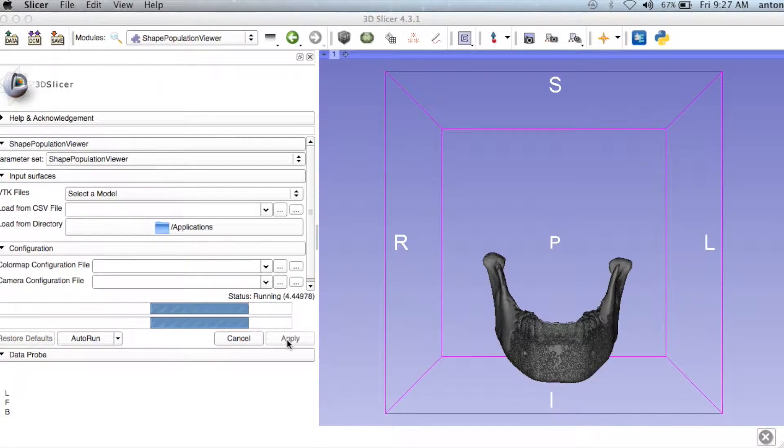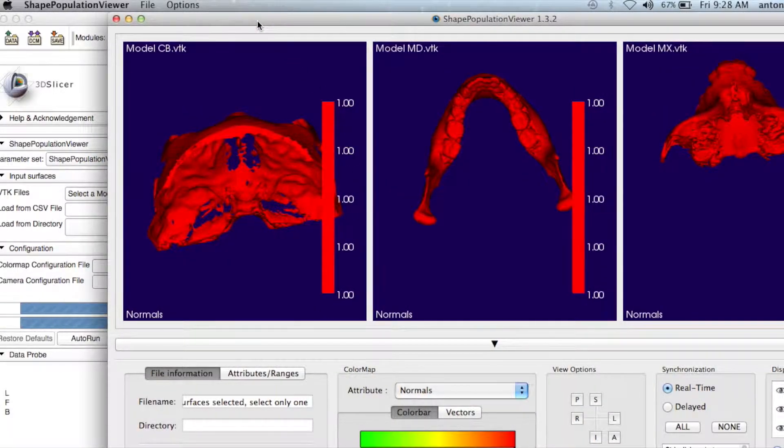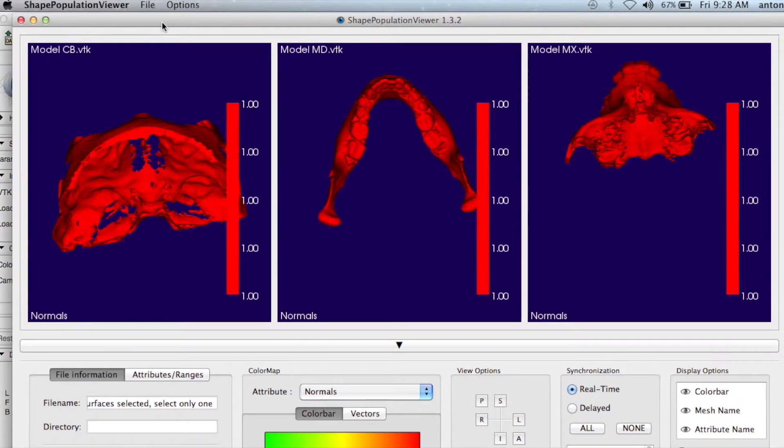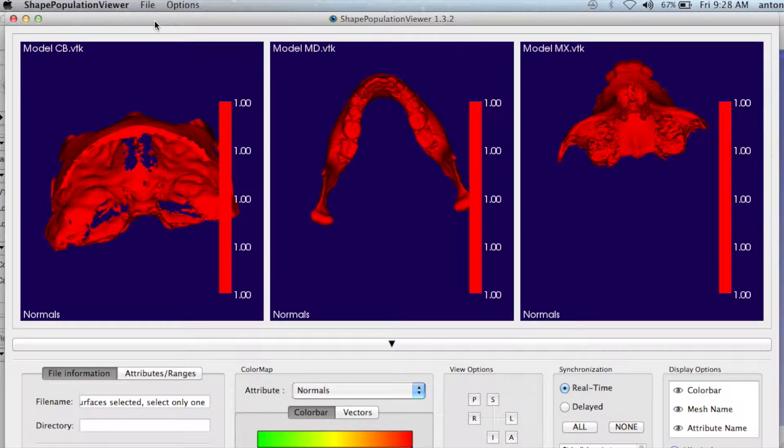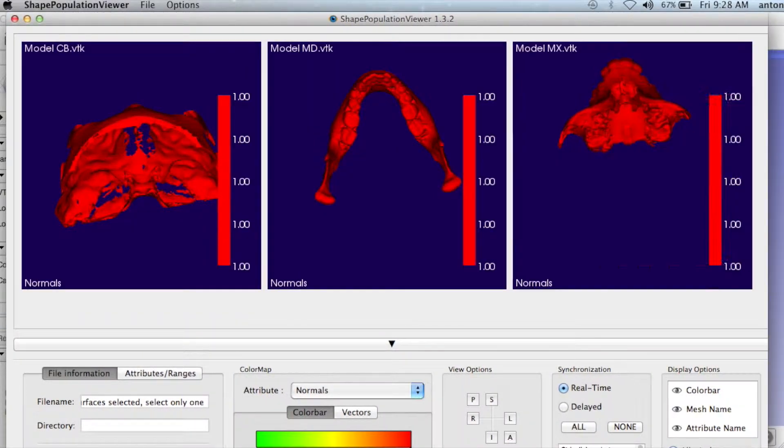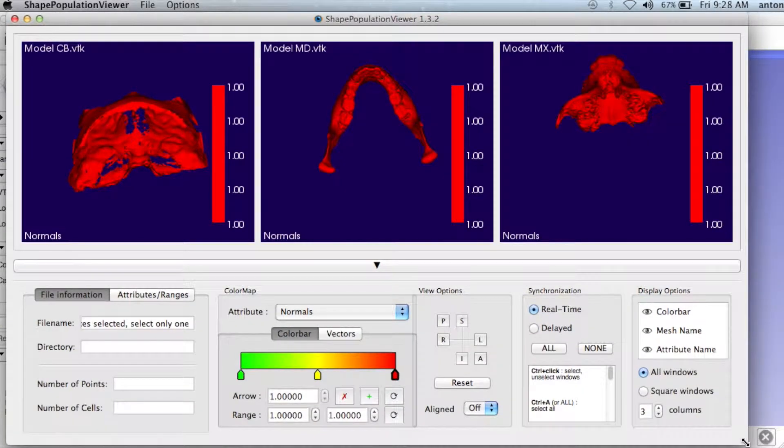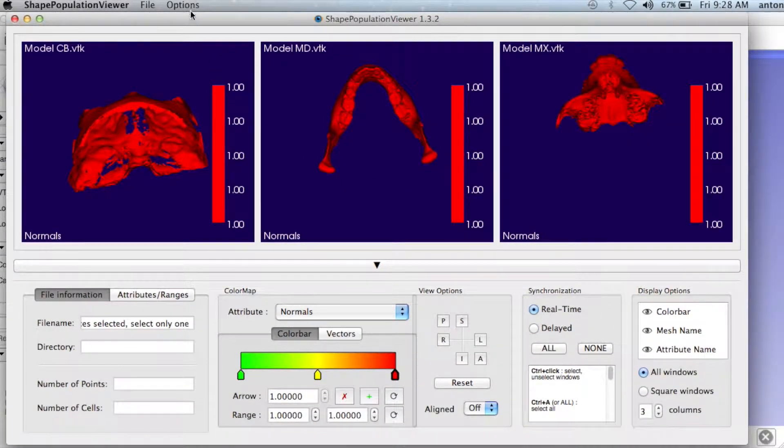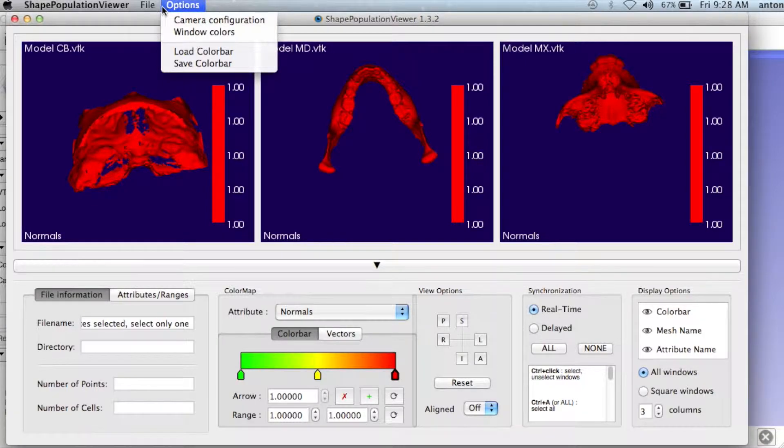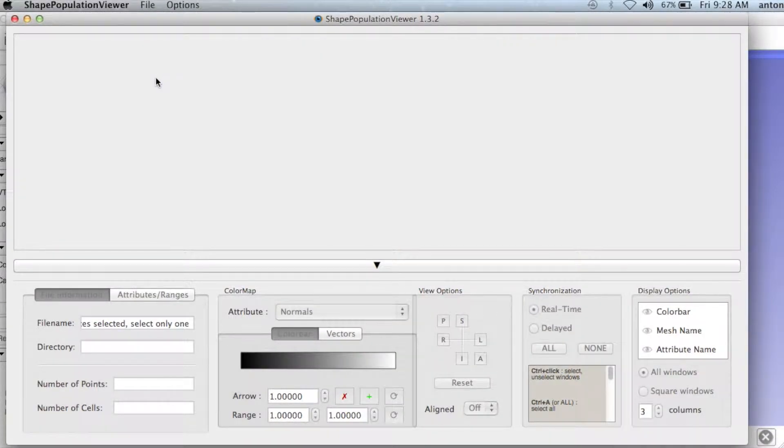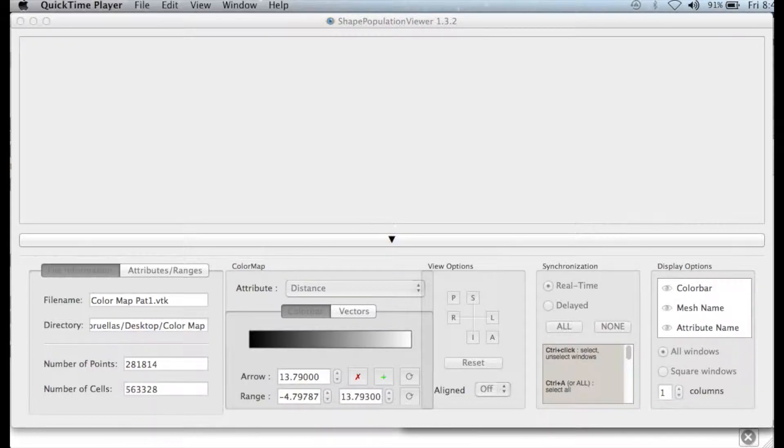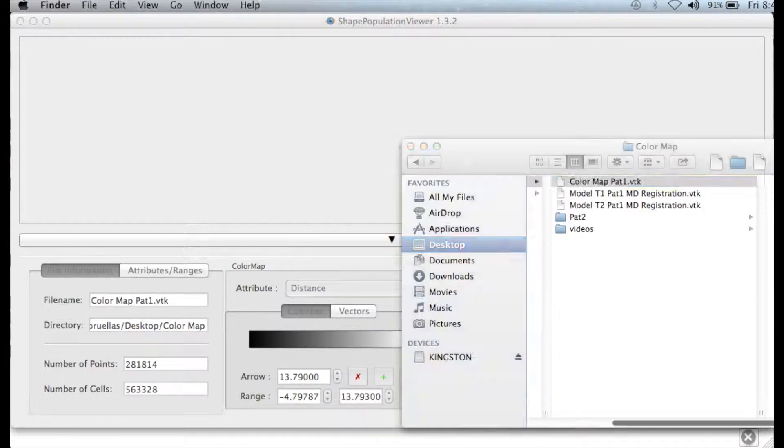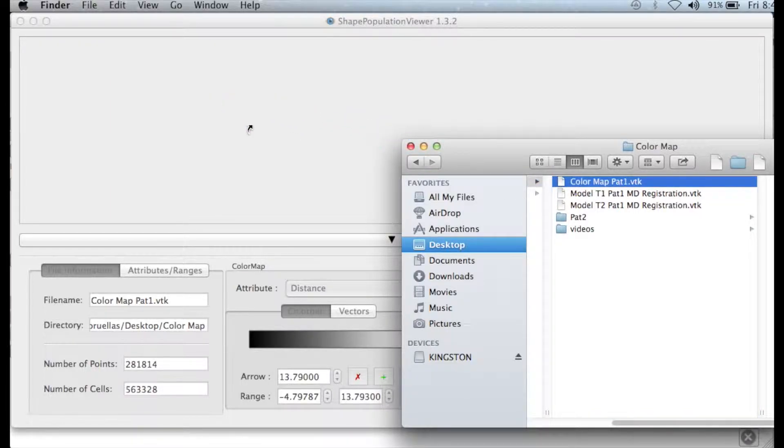A new window will pop up. If the new window already has loaded files, go to File at the top of the page and click Delete All. If nothing is open in the window, go ahead and drag and drop the color map into this window.